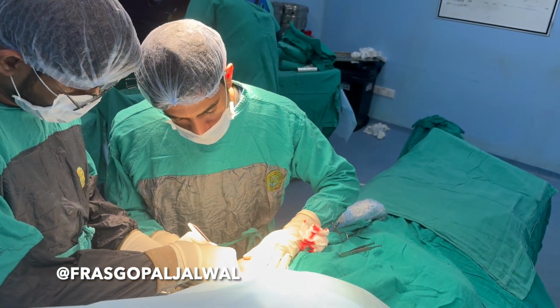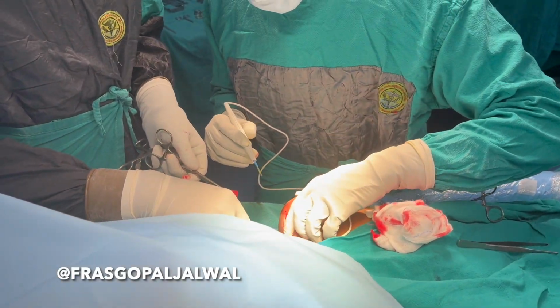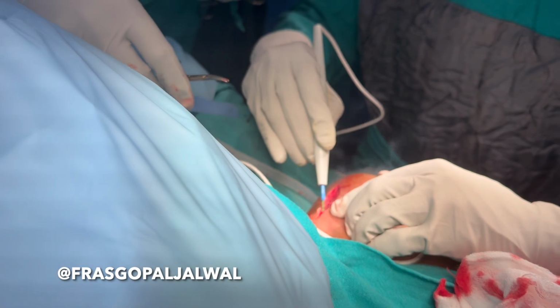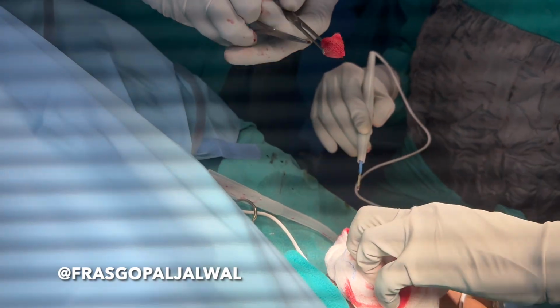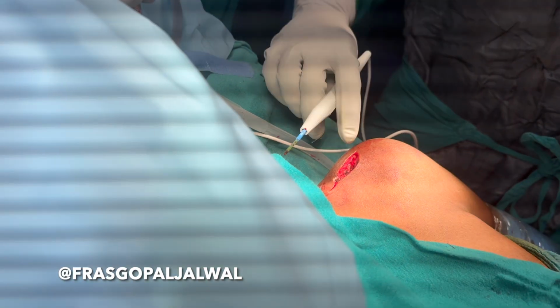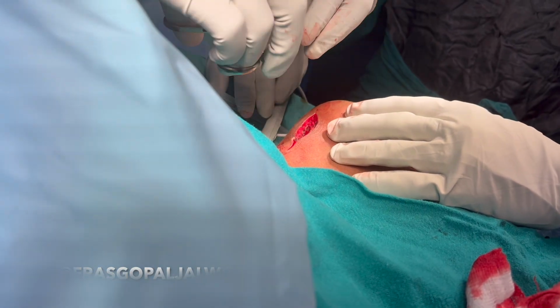After performing the block, you can see that we have not given any sedation, and the patient is very comfortable, and surgeons are operating on the clavicle. This patient has a fracture of the lateral third of the clavicle.